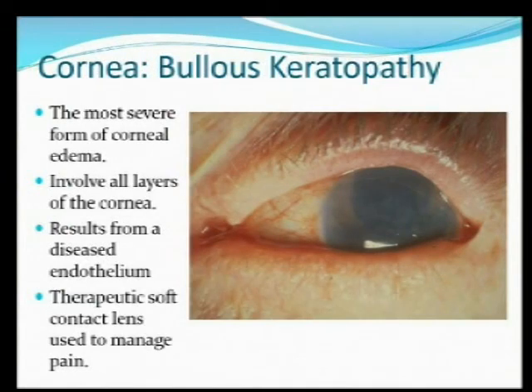But the good news is we can place a therapeutic soft lens on there, and now we have a barrier between the air blowing on there and the nerves, and they get instant relief. That's certainly a great application for a therapeutic contact lens.